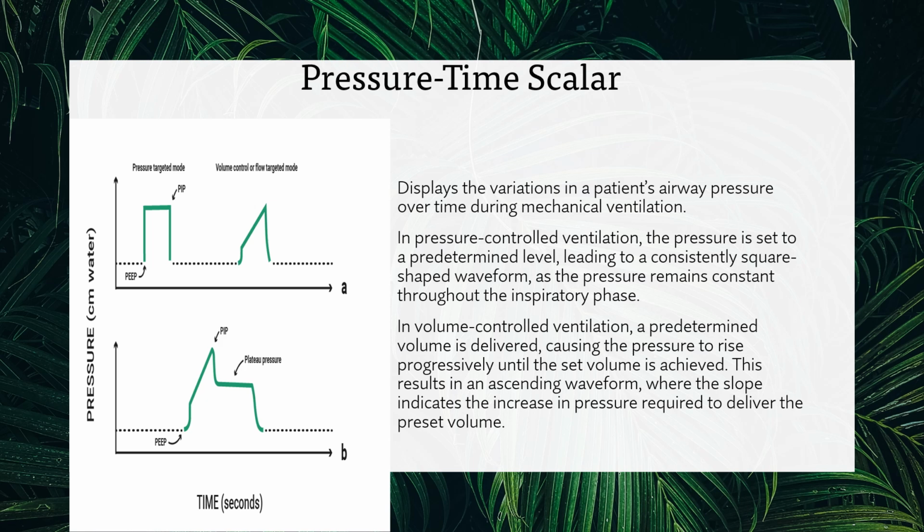This is pressure time scalar. Pressure time scalar is a ventilator graphic that displays the variation in a patient's airway pressure over time during mechanical ventilation. The mode of ventilation influences the scalar shape.